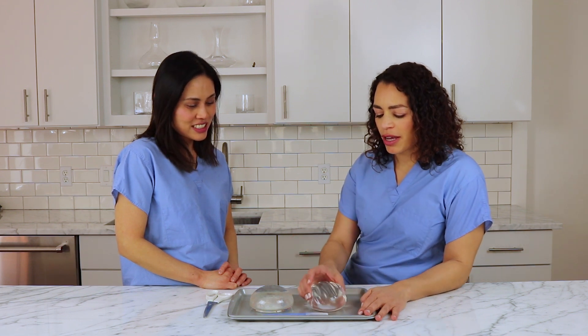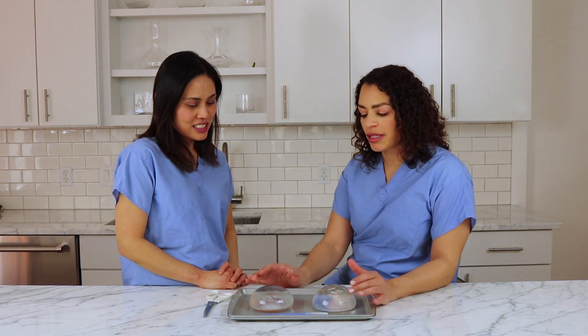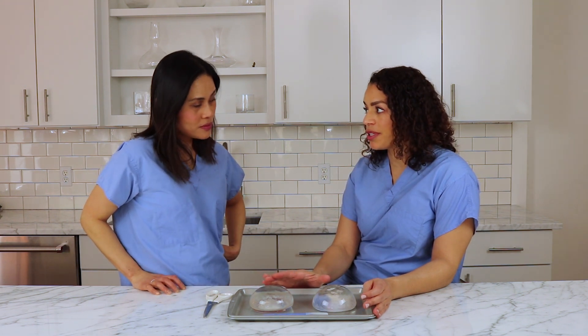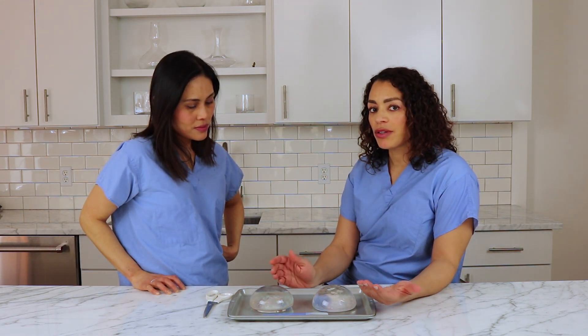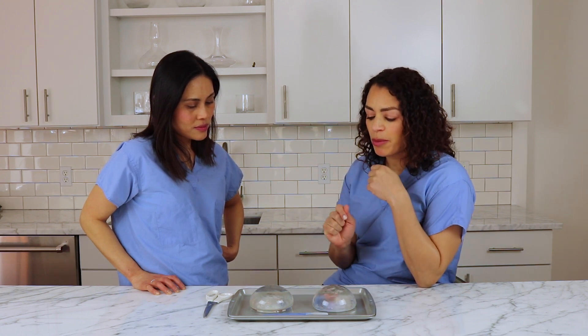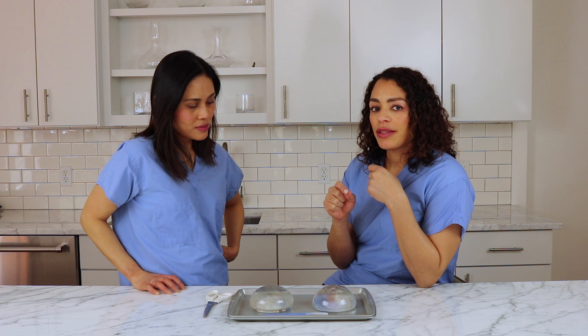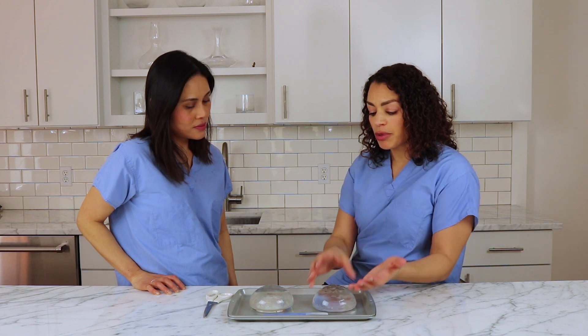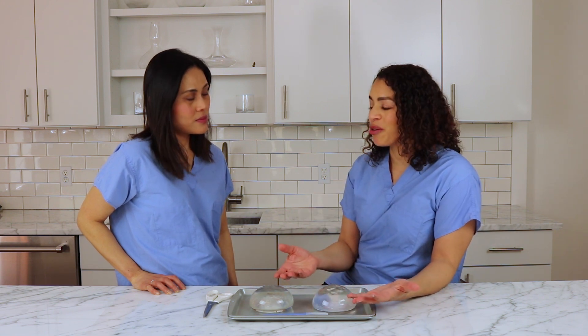Well, I brought two silicone breast implants, one from each of the main implant manufacturers in the United States. The reason why I decided to do this video is I think it's important for women when they decide that they want to have breast implants, whether it's for breast augmentation or for breast reconstruction, to know what they're putting inside their bodies.